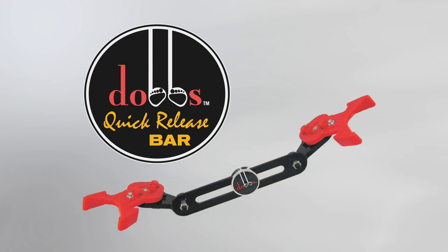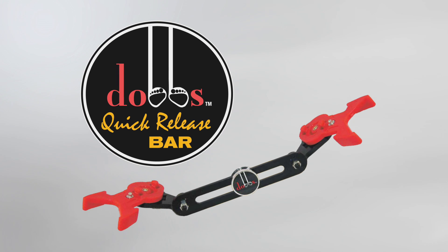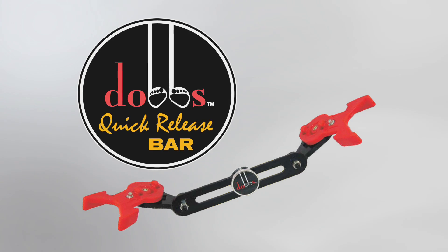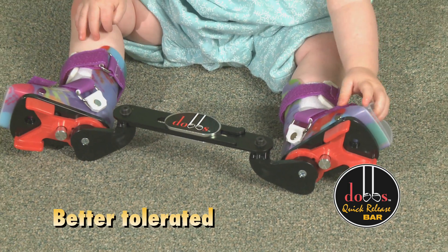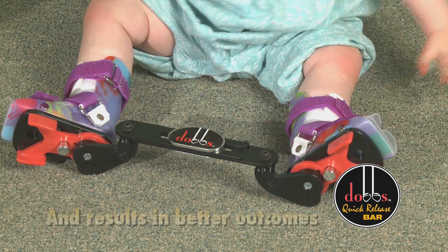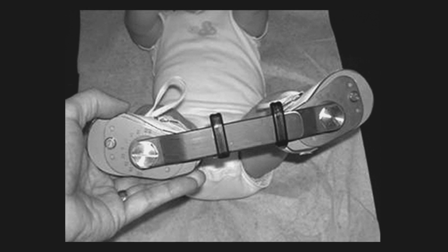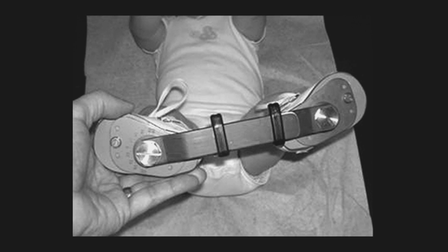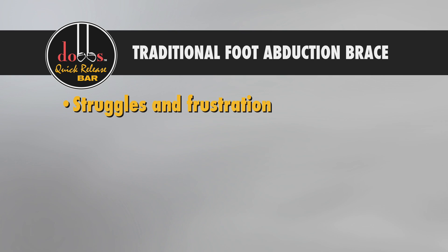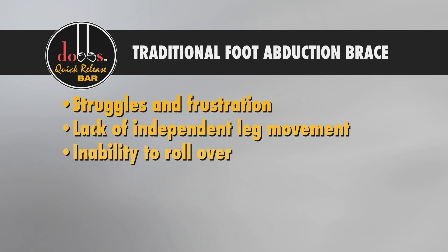Introducing the Dobbs Bar, a new device that transforms an old idea into a more clinically efficient choice for the treatment and correction of all types of clubfoot. Created by Dr. Matthew Dobbs, the Dobbs Bar allows more freedom and relief for children and their parents. In a traditional foot abduction brace, the child must learn to move both legs together and at first usually struggles and becomes frustrated by the lack of independent leg movement and the inability to roll over.